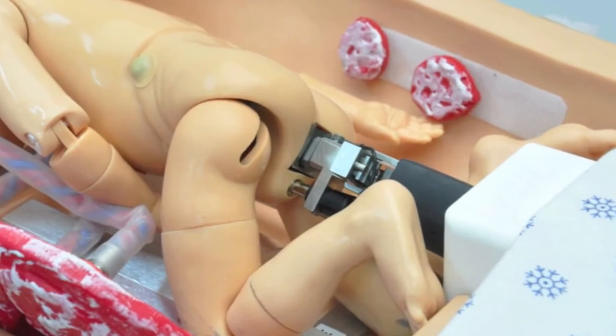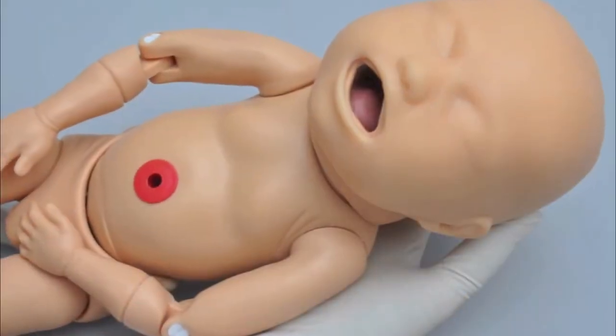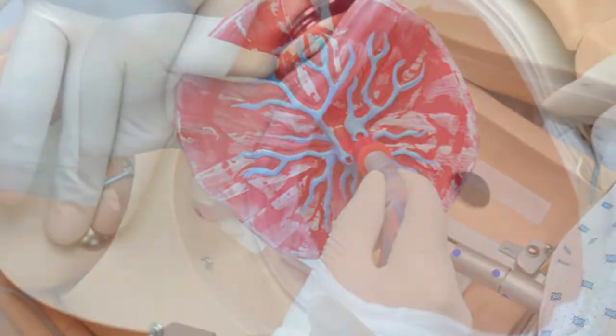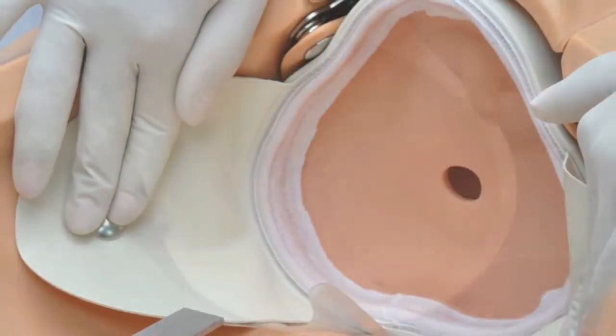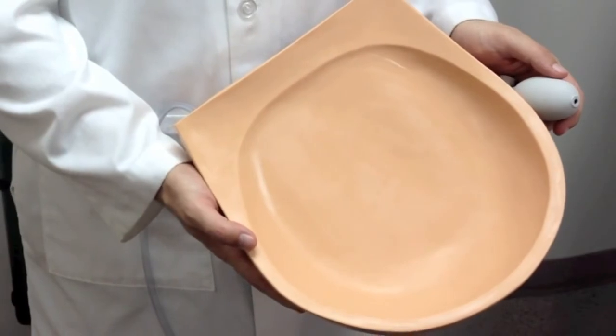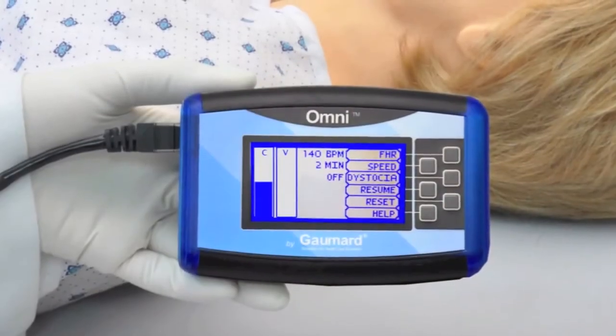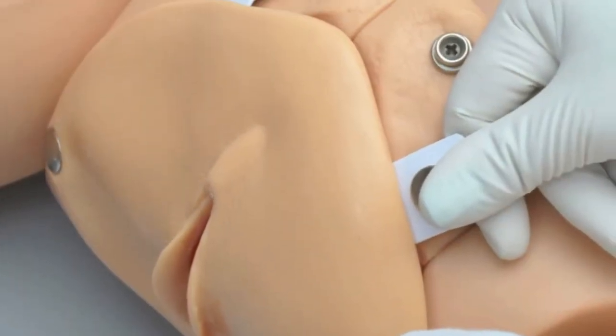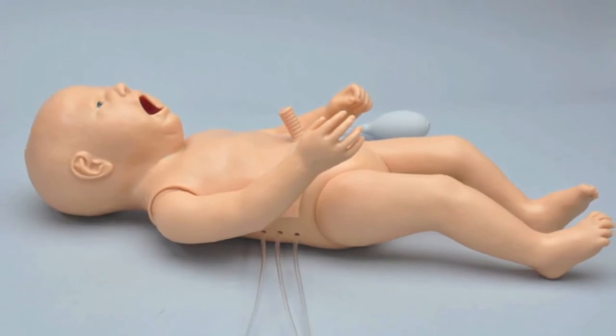The NOEL 550 includes a full-size simulator, automatic birthing mechanism, articulating fetus, placentas, removable cervices, base for Leopold maneuvers, Omnicontroller, CPR-link software and cable, vulval inserts, and intubatable neonates.